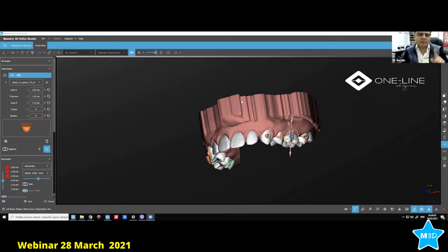I'll just try to show you one of those cases. Okay, so is intrusion not made by... yes? I think Avri, you got the answer, right? Zain is asking regarding the case you presented, that the planning was wrong due to excessive intrusion. Yes, I have shown you the same case before.